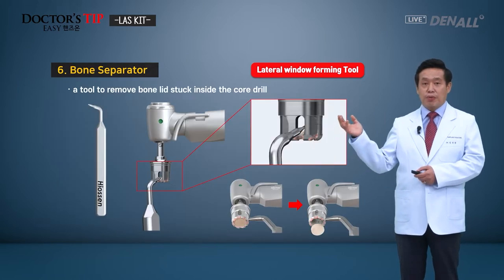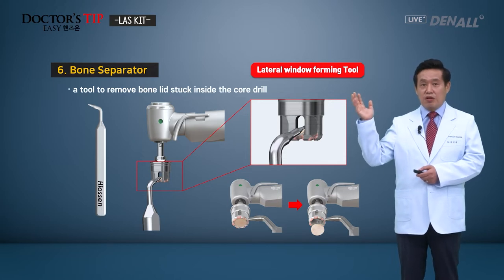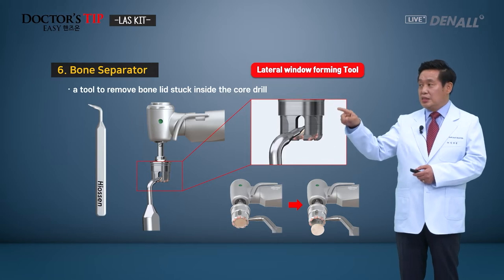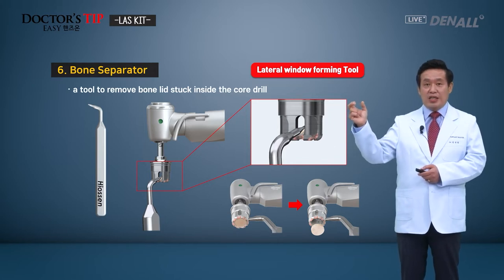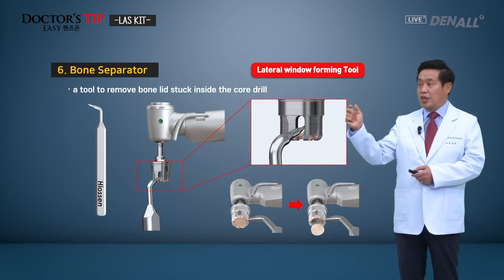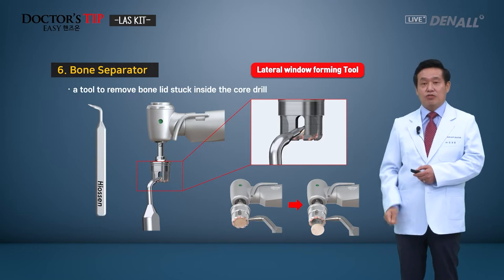Now there is a bone separator. This is a tool to remove a bone lid stuck inside the core drill. If you have a lid left in the center, it's very hard to remove, but for that, you can use this instrument.